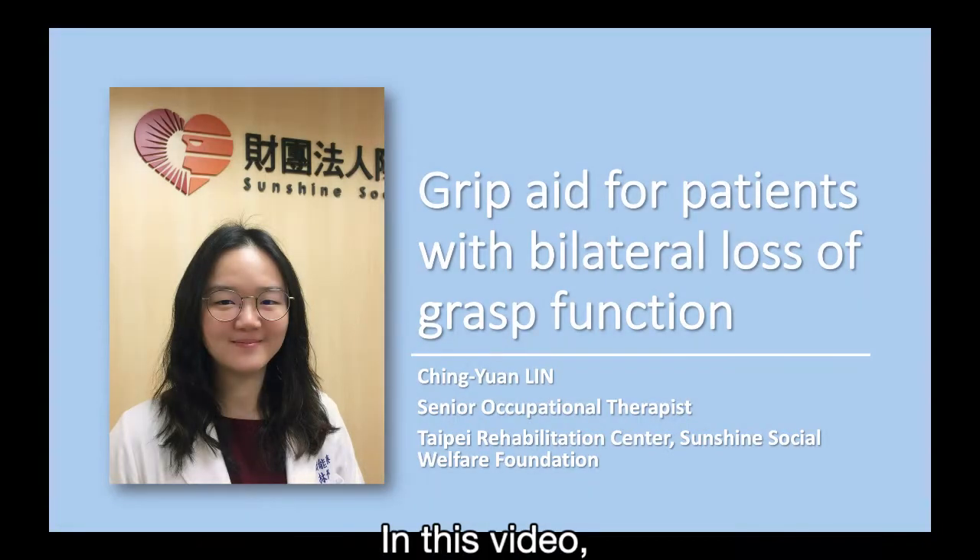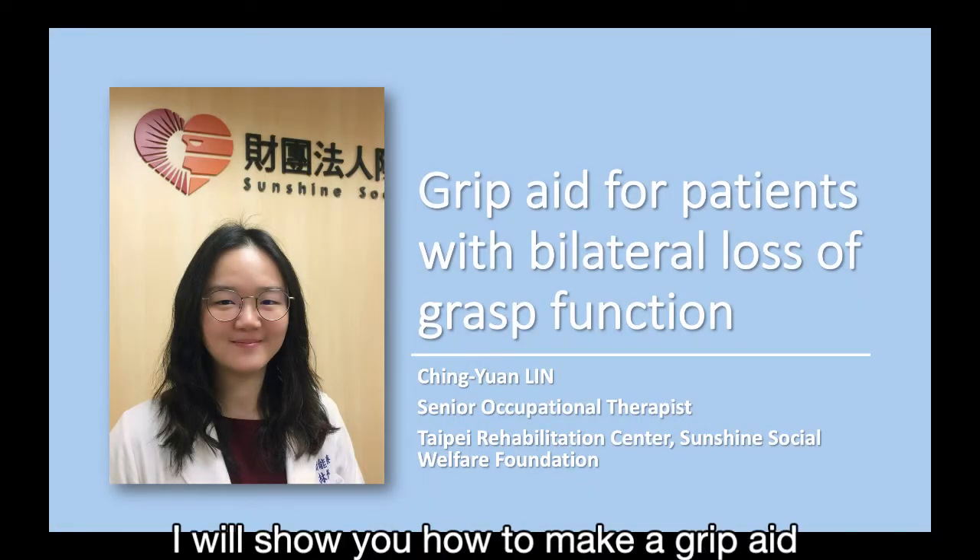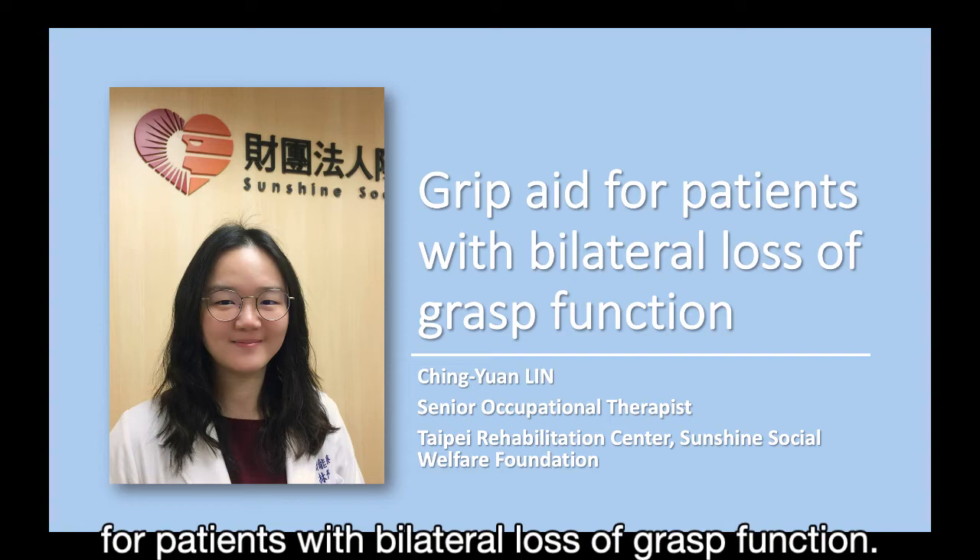Hello. In this video, I will show you how to make a grip aid for patients with bilateral loss of grasp function.